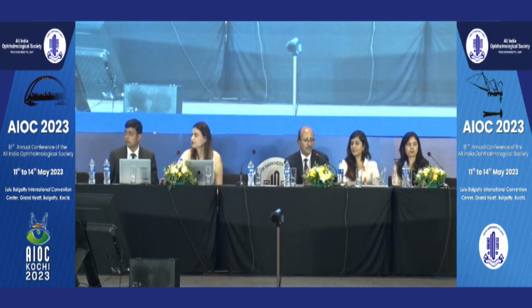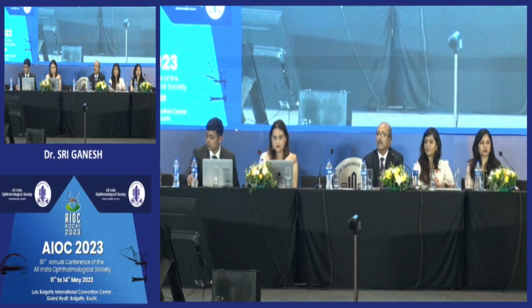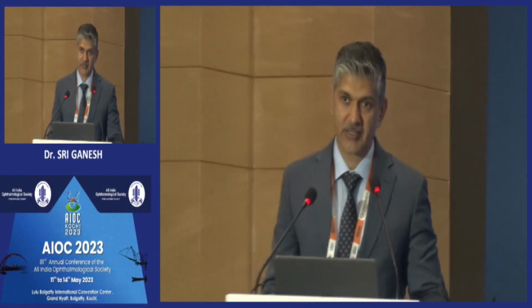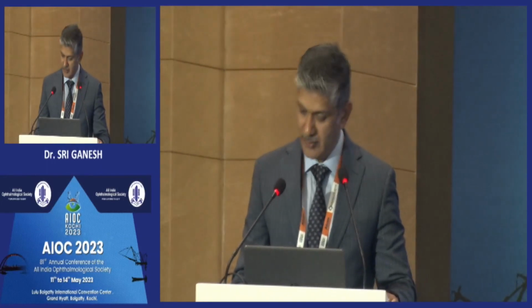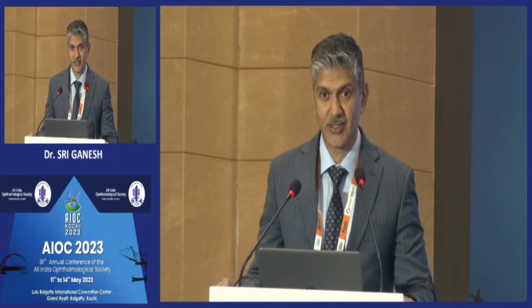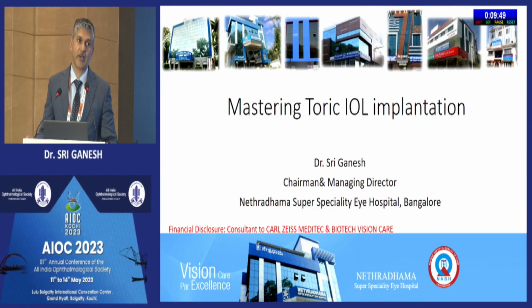So we'll go on to toric IOL implantation, mastering toric IOL implantation. Again, it's very important to manage astigmatism during cataract surgery, and one of the main reasons for dissatisfaction is residual astigmatism after cataract surgery, especially if you're using a premium IOL like a trifocal or a multifocal. Your astigmatism has to be within 0.5 diopters, otherwise the results would not be optimal and the patients will not be happy.